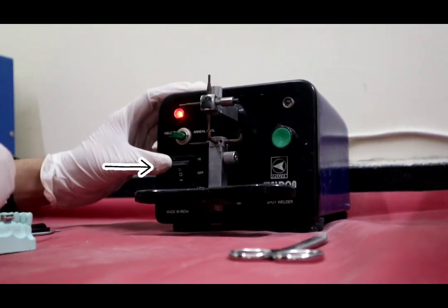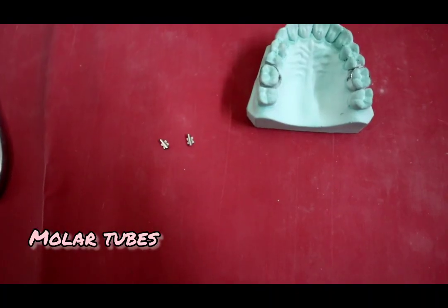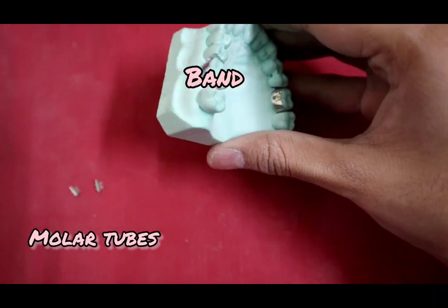This switch regulates the intensity of heat produced, and this switch activates the welder. In this video, we will weld a molar tube to a band.